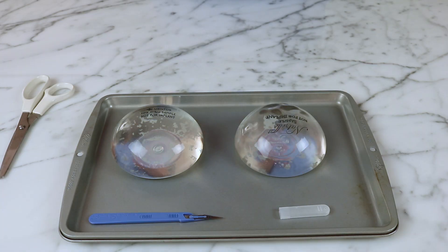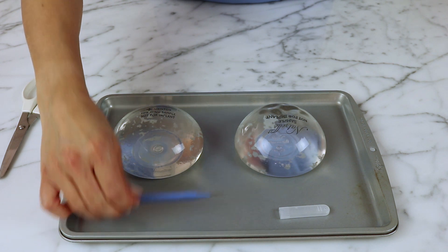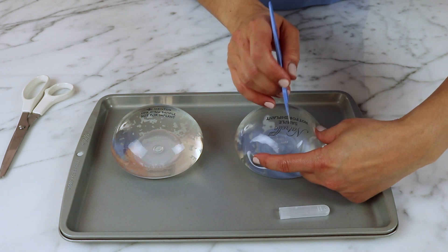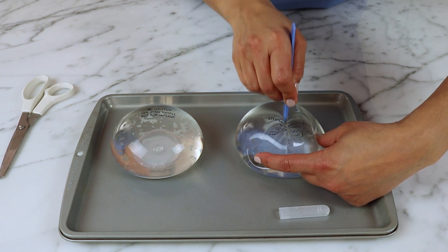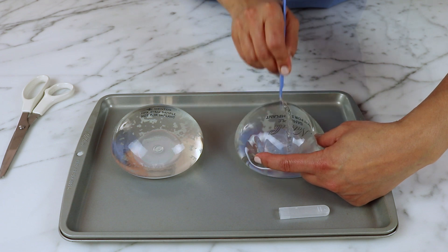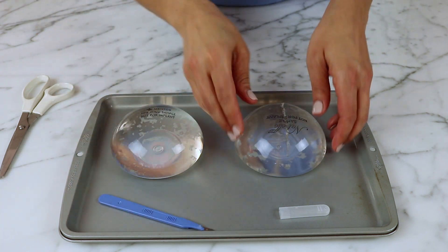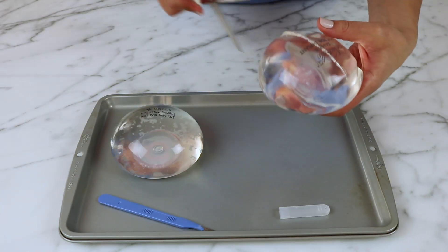So here are the two breast implants. We're going to go ahead and cut them. I will use this scalpel to cut the implants. Of course, this would never be done in real life, so you don't want to replicate this video. This is the first implant cut and I will finish the cut with scissors.